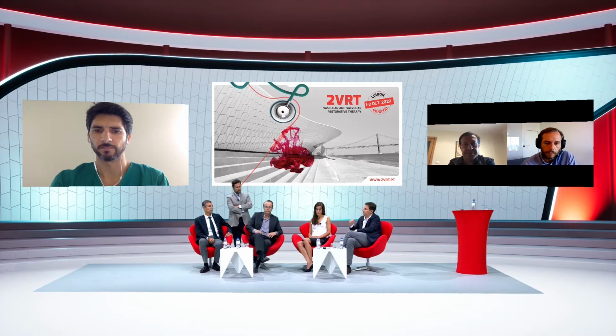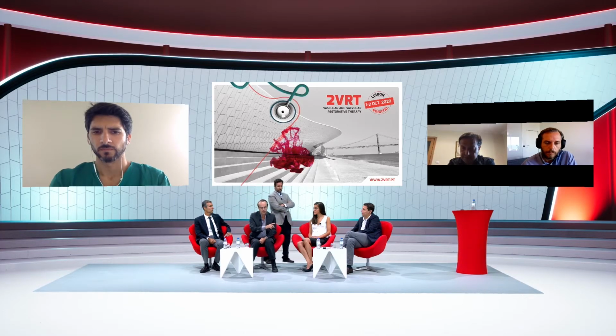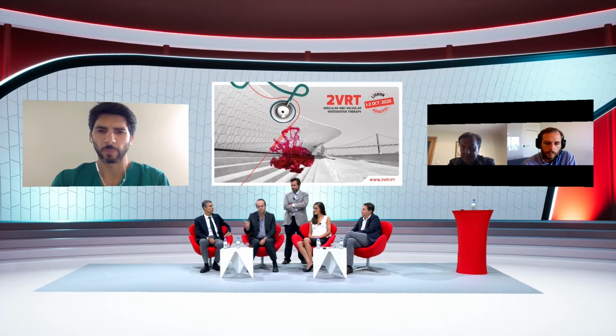Henrique, I'll do a few quick comments. On Mariana's case, I've been in the room. The Edwards valve would be a bad option also because of the size, because the valve annulus was really at the top limit of the Edwards valve. So even for the size, the Edwards would not be a solution.